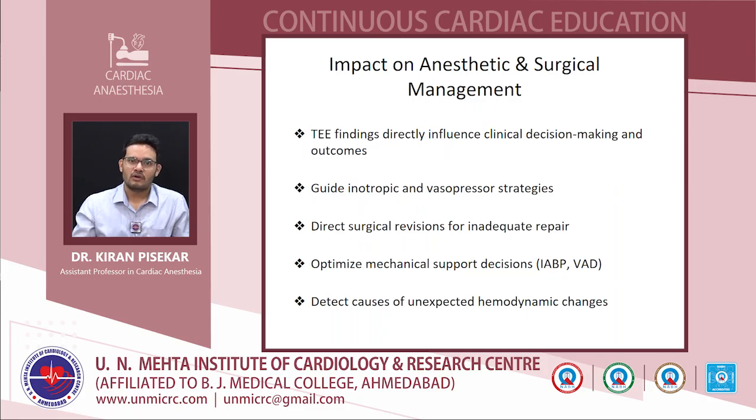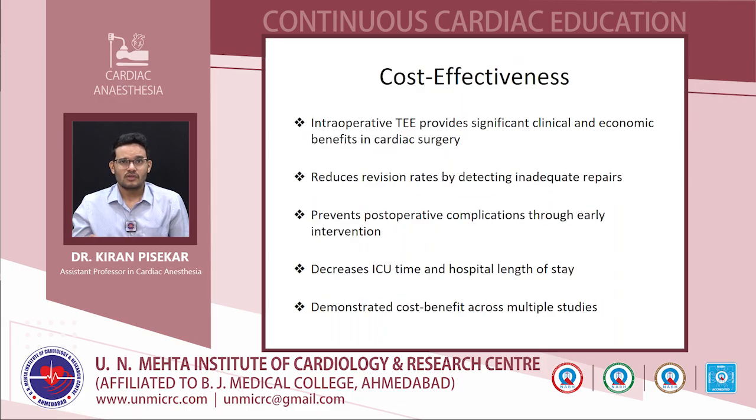Simultaneously, we are going to measure the VTI in the LVOT before and after the leg raise test. If there is a difference in the VTI by more than 20%, then it is a good indicator of fluid volume responsiveness. So TEE is very cost effective, and as we have seen earlier, it will alter the outcome, and hence the cost as well.